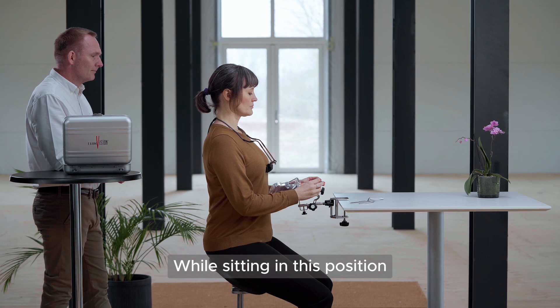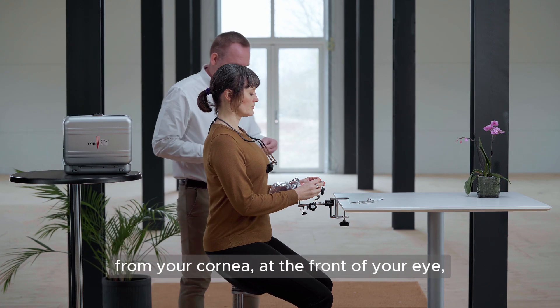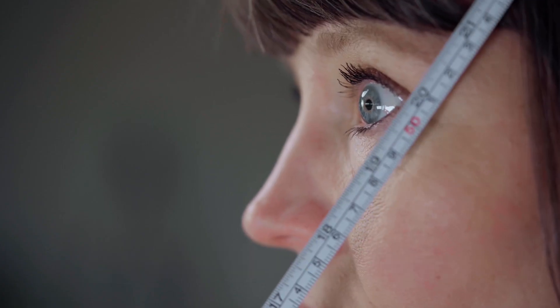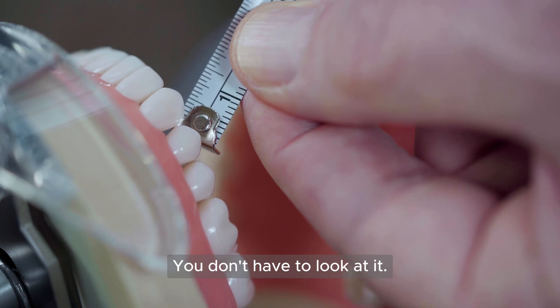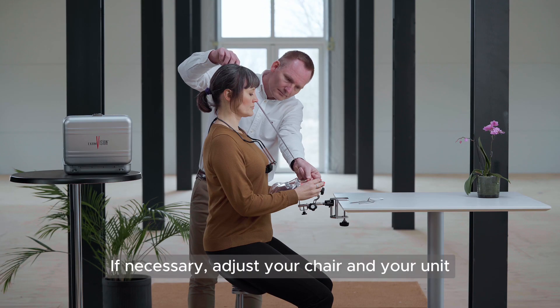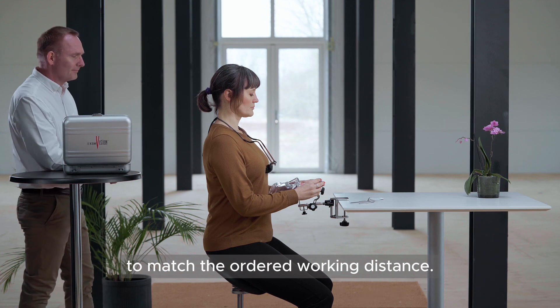While sitting in this position, ask your assistant to measure from your cornea, at the front of your eye, to the point you want to focus on. You don't have to look at it. If necessary, adjust your chair and your unit to match the ordered working distance.